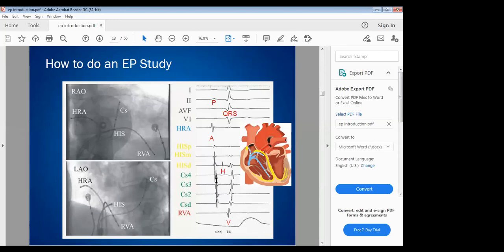So that's what explains this wave. Now, as I said, I don't want you to get confused. Sometimes you can see the wave, especially when you are seeing AVRT, AVNRT, the wave can look confusing. The first thing you look at is your surface ECG. Don't miss the surface ECG. On the surface ECG, you can see the P wave. You can see QRS activity, right?